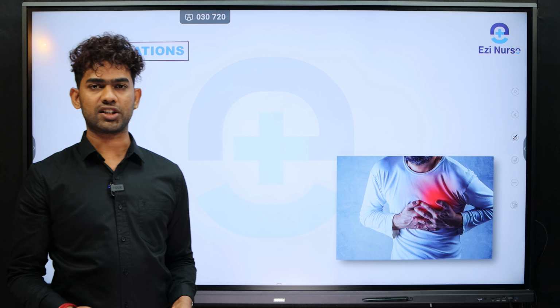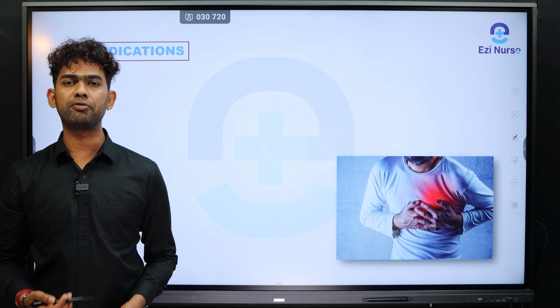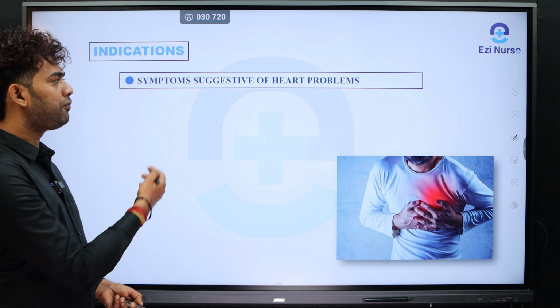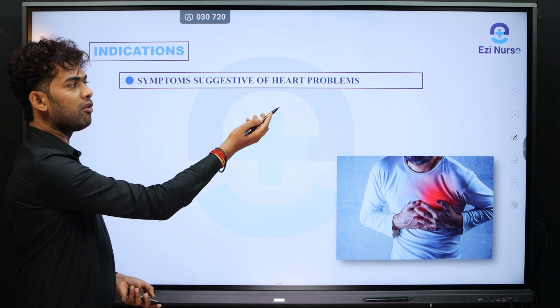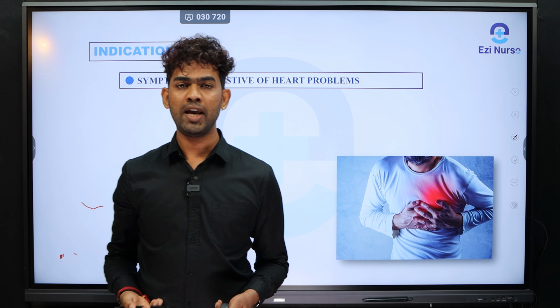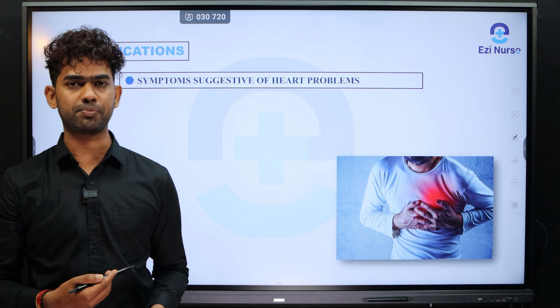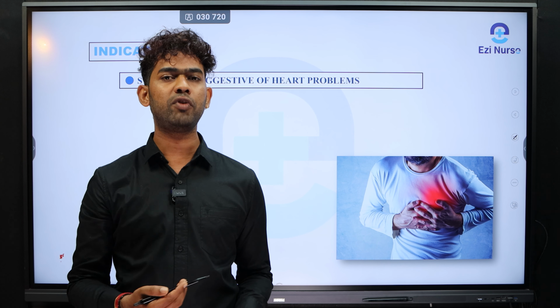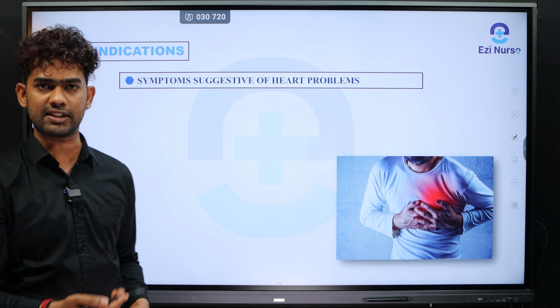Next will be the indications. What are the situations in which we prefer to perform an ECG? Let's move on to that. The first will be the symptoms suggestive of heart problems. Yes, the symptoms related to a heart problem, especially left-sided chest pain. If the patient is experiencing left-sided chest pain, then we should recommend the patient to do the ECG.